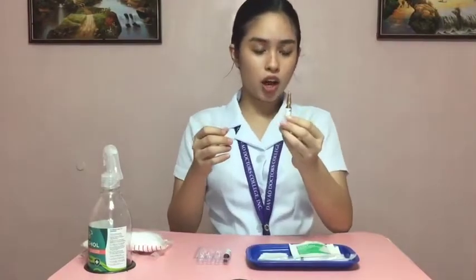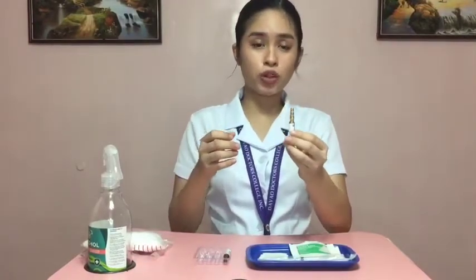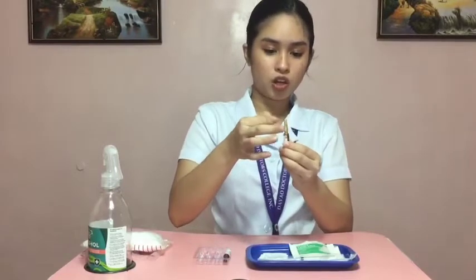So now, after doing the hand washing, let's prepare the medication ampule for drug withdrawal. First things first, let's get the ampule and flick the top of the ampule with our fingertips so that the medication will go down and not stay at the top.